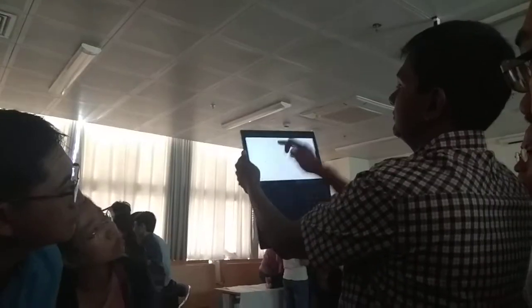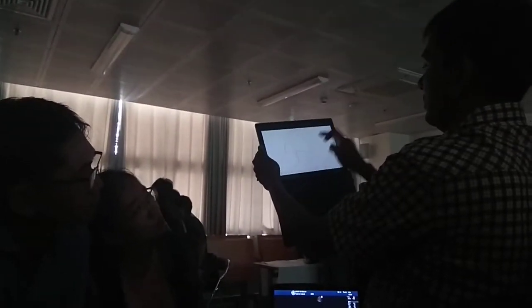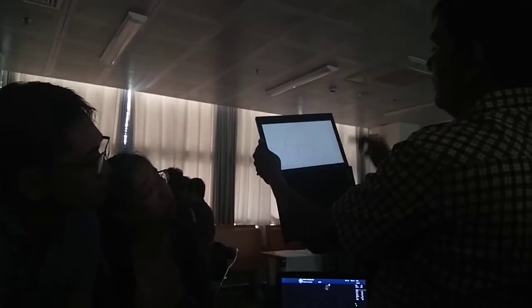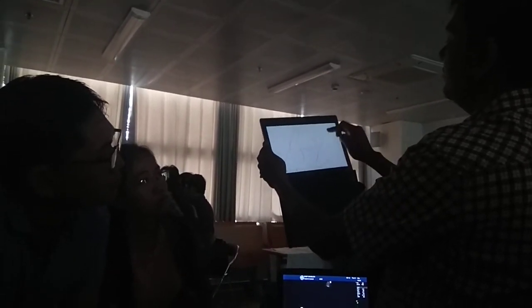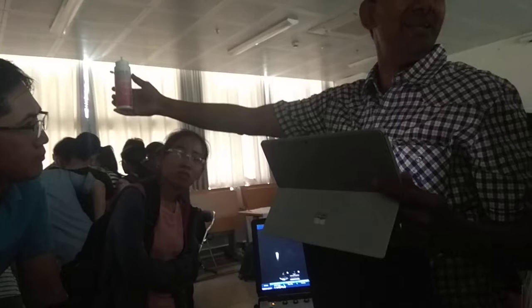You have to have a depth that is this much. That must be the depth. If instead it's so very deep that you have right ventricle, left ventricle here, and all this is extra depth, it's a waste. You can't really see anything.